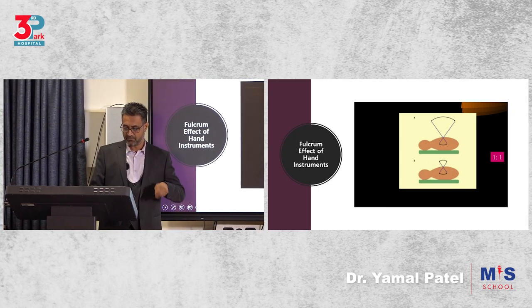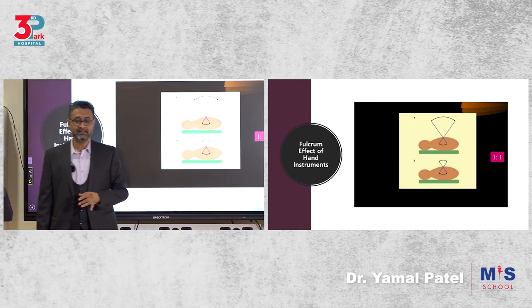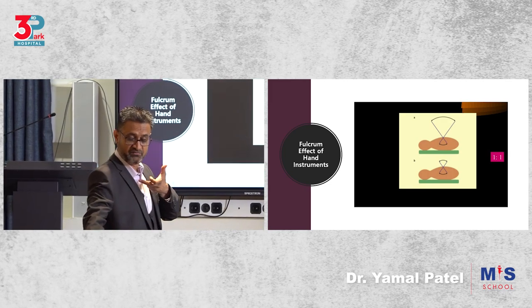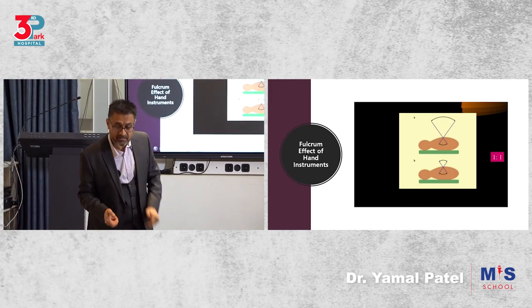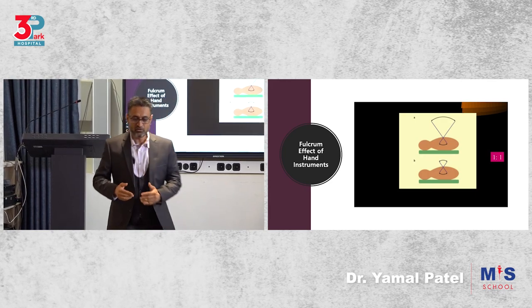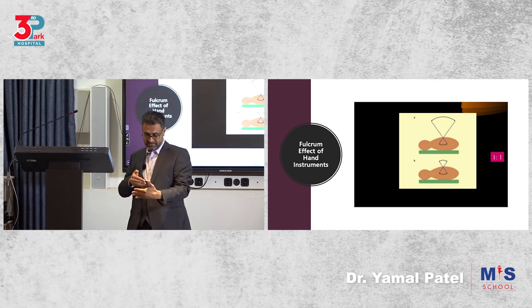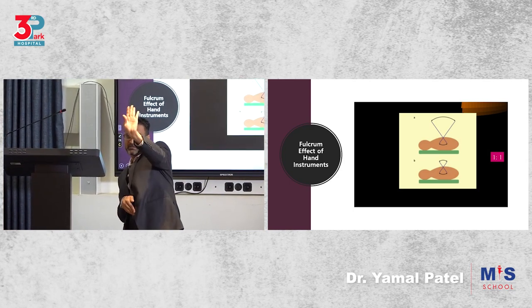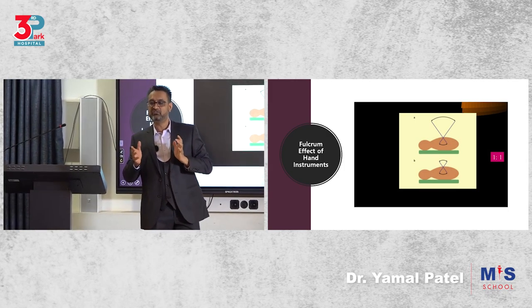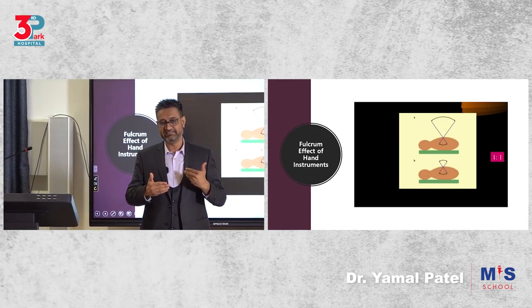We've discussed this. Remember, it's opposite movement, and try and maintain a 1:1 ratio if you can. So don't go too close to the pathology. Then you have too much of an instrument out and very little in, so you'll have to move so much for a little to move inside. Don't stay too far from the pathology either, where you have your port here and the tissue is there. You'll move this way and that instrument moves so much there. You get it?